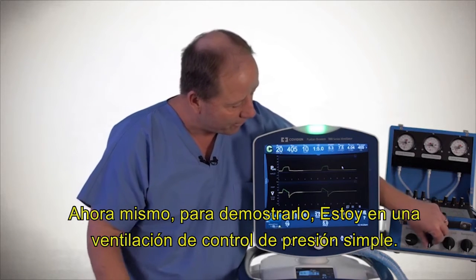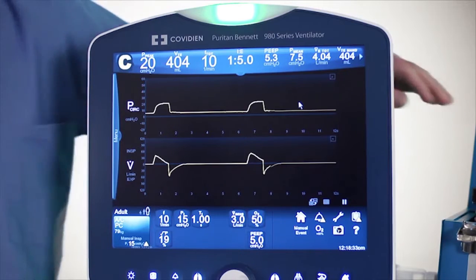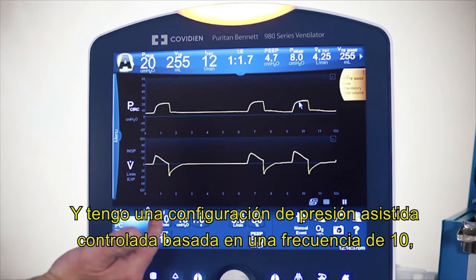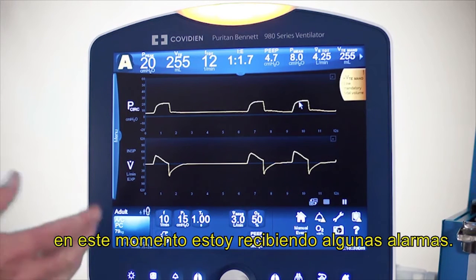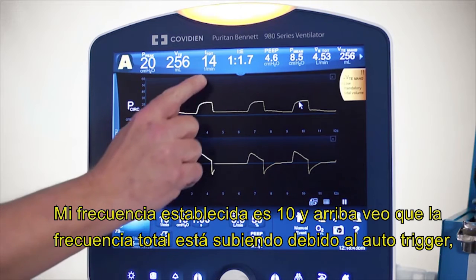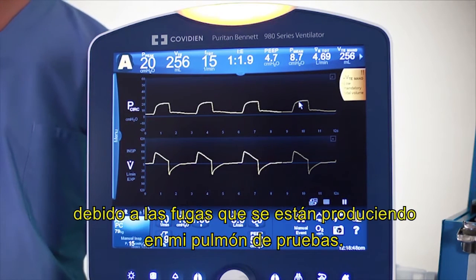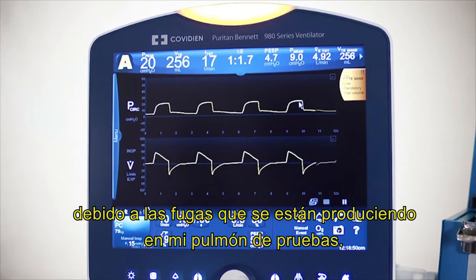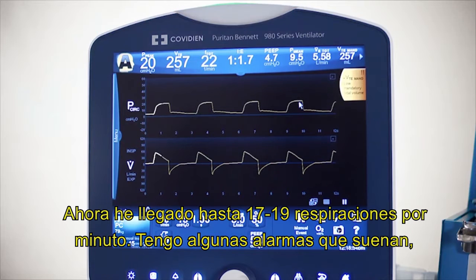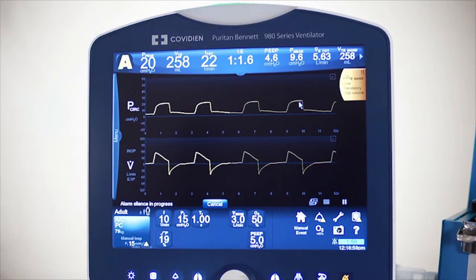Right now, to demonstrate this, I'm in simple pressure control ventilation. And so I have a simple setting of assist control pressure based, a rate of 10. Right now I'm getting some alarms basically going off. Now my set rate is 10, and I want to notice at the top that the total rate is beginning to climb because of the auto-triggering occurring from the leaks that are occurring from my test lung. And so right now I'm up to 17, I'm up to 19 breaths per minute. I have some alarms going off, which is not uncommon with leaks.